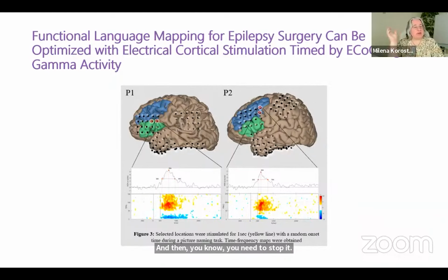Or open and close your hand, yes, for 30 seconds, and then stop. Not really very effective. So you can see, especially with developmental delay, children who don't stop on time. So basically your resting period overlaps with the active period. There are things like this. Sometimes they just forget.